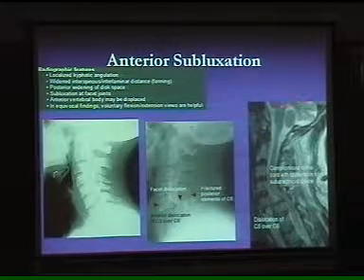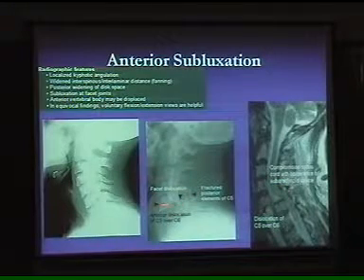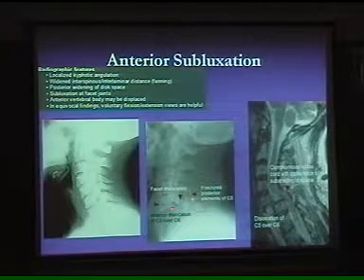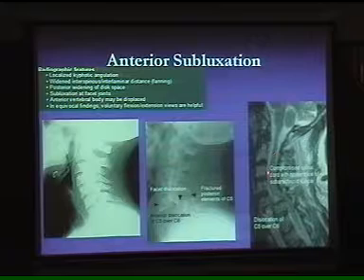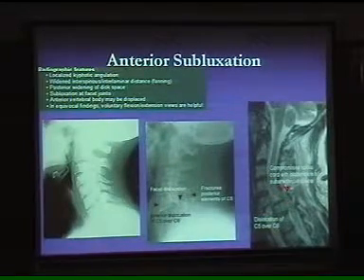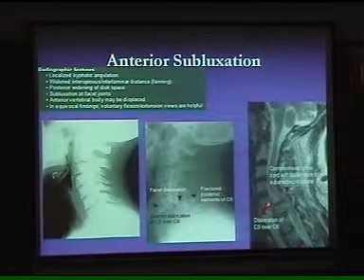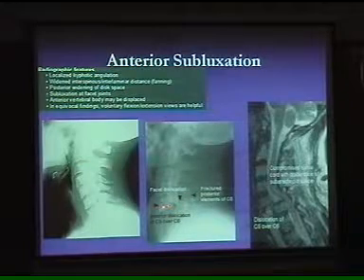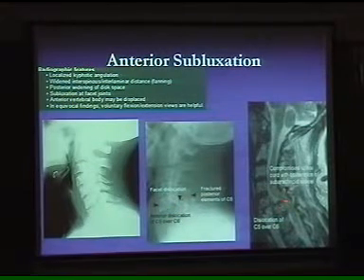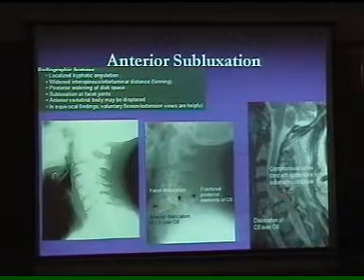The purpose of MRI: look at this brain tissue, look at the spinal cord. The message is not only to see this fracture, because that is managed. The important thing for the surgeon and the orthopedic surgeon is how far the effects of this go. Is the patient going to get quadriplegia or not? Look at the spinal cord and look at the level it's being pushed. So this spinal cord is pushed anteriorly. That means it's not only a fracture or subluxation, it is causing impingement over the spinal cord, which needs to be corrected, and that's why the patient can survive better.